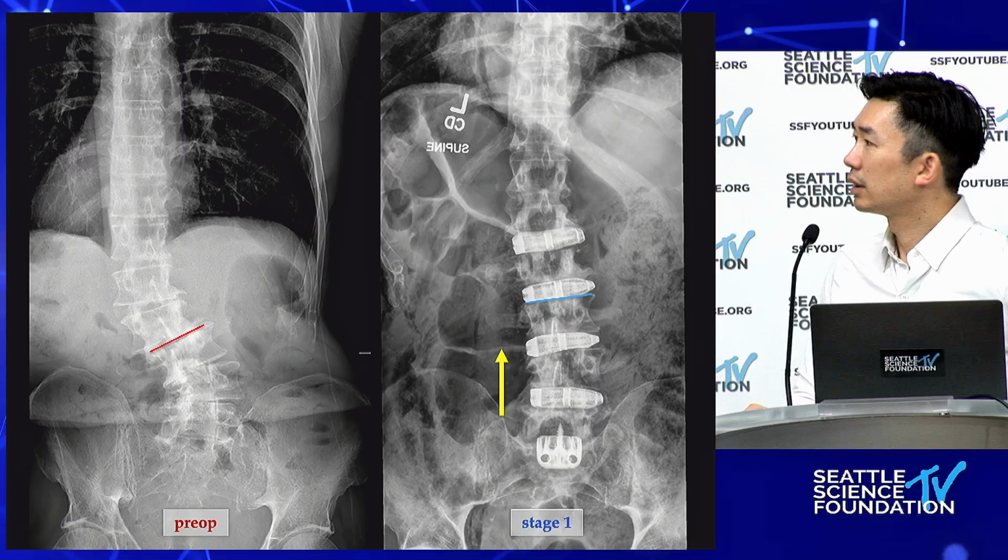It seems like you've inserted pretty much the smaller side first on those. Well, I guess actually at 2-3 you went larger side first. Does that take some extra care, you know, not to violate the end plates? I mean, it seems natural, right? The cage you have at 3-4, okay, fine, you fit it in there and you fix the curve, but you're kind of going backwards there at 2-3. Look, nicely done with no subsidence, but I'm just curious if there are any technical points on that.